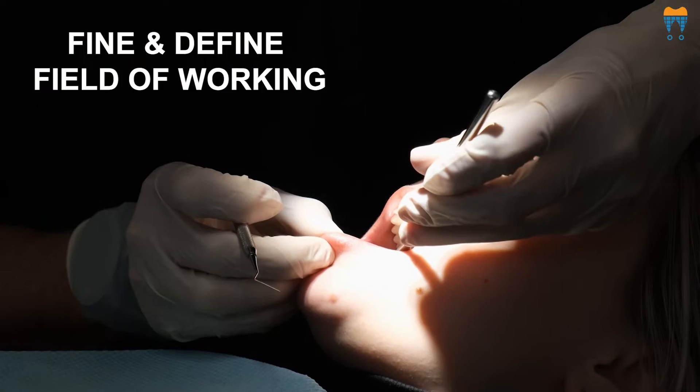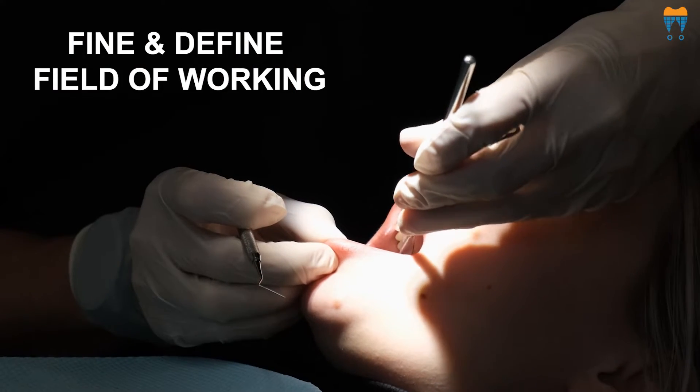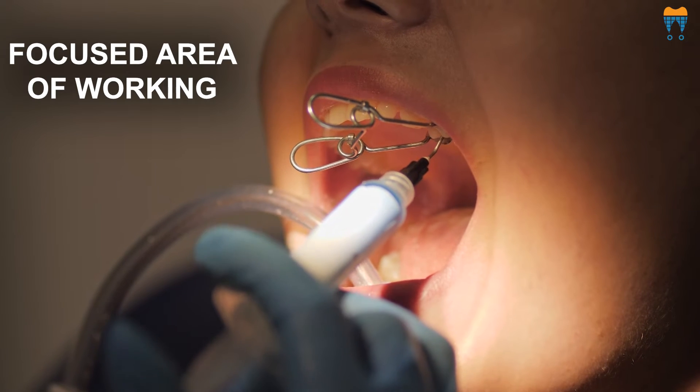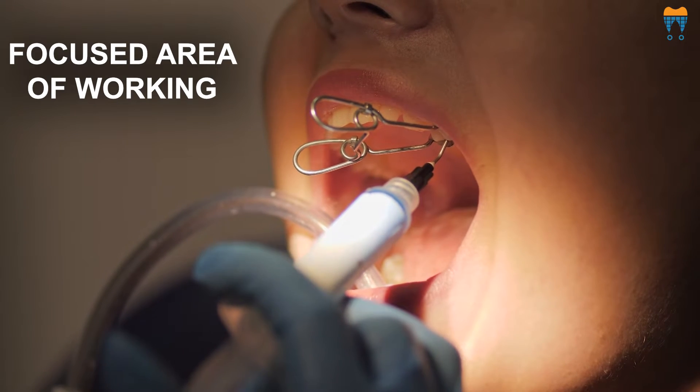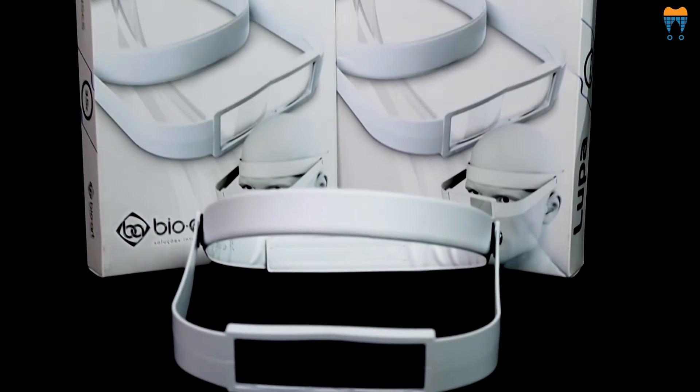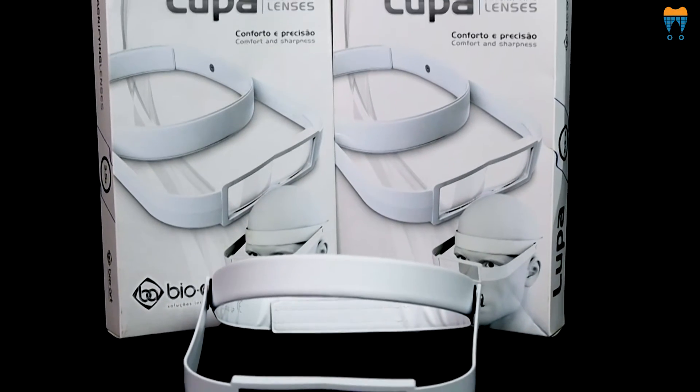The third indication is having a fine and defined field of working. In precise procedures such as endodontics or any detailed work, a focused area of working helps us perform much better. Dental loops help us achieve that through magnification.